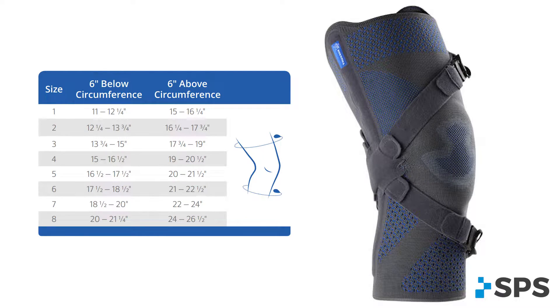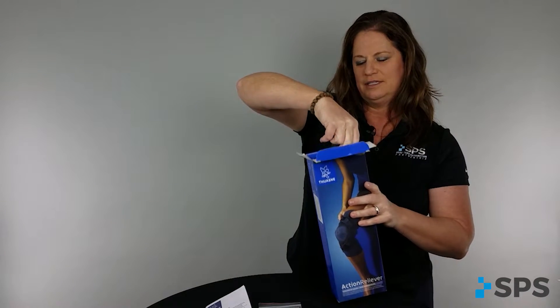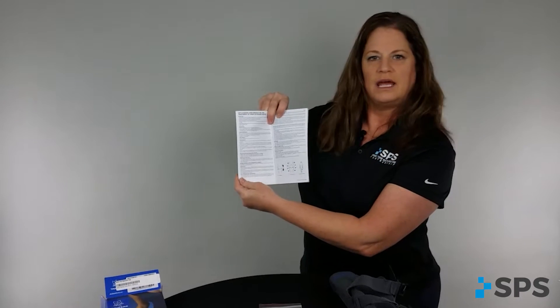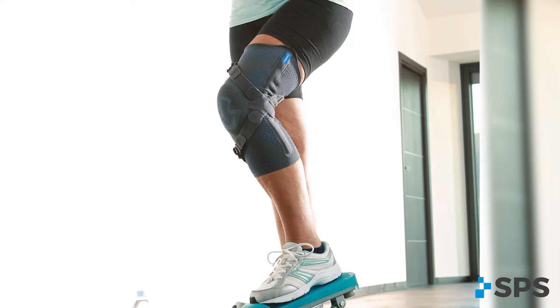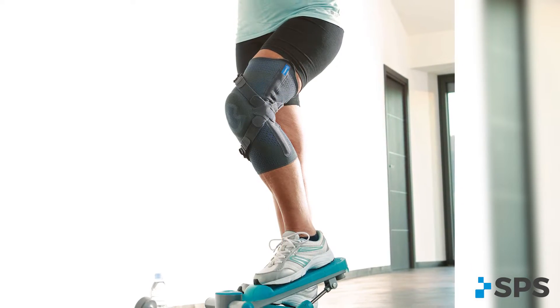Inside the box, you have an instruction manual and a knee orthosis — the Action Reliever. The instruction manual goes through how to fit the brace step-by-step with your patient, and it's important that the clinician follows these guidelines to ensure a really nice fit.